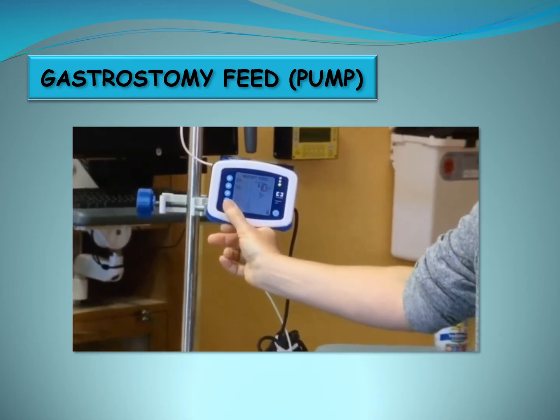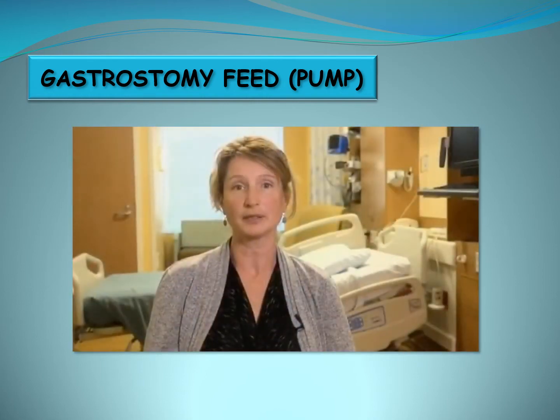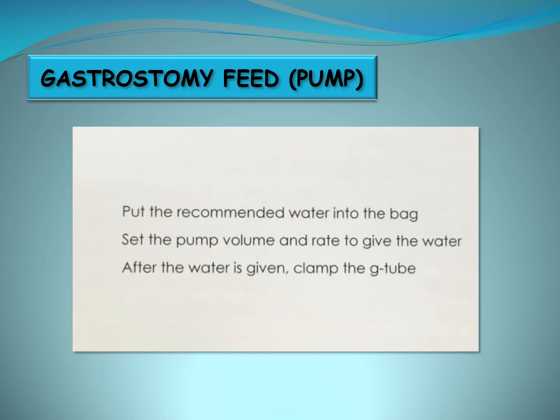Some children will need extra water. Your child's doctor or dietitian will let you know if extra water is needed. Put the recommended water into the bag. Set the pump volume and rate to give the water. After the water is given, clamp the G-tube.